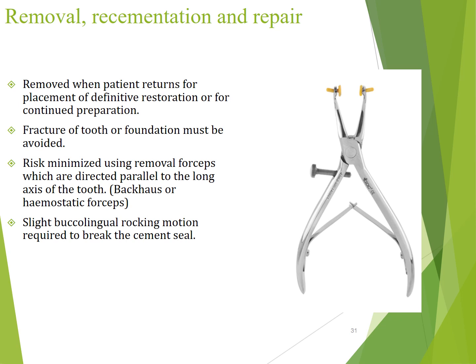So coming to the removal, re-cementation, and repair, it can be removed in certain cases, and so basically, whenever we are removing or re-cementing or repairing, fracture of tooth or foundation must be avoided.